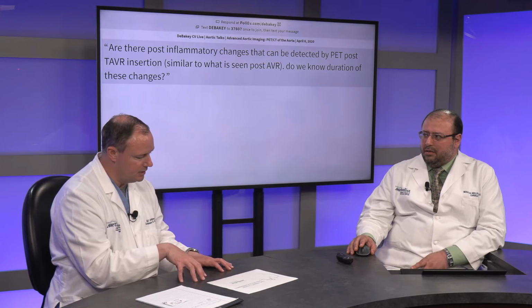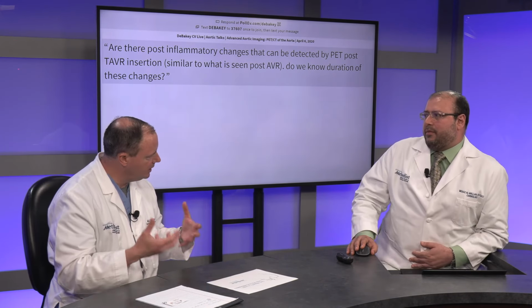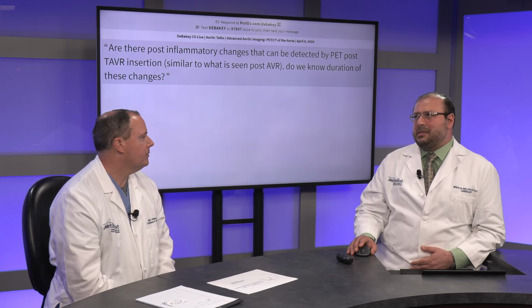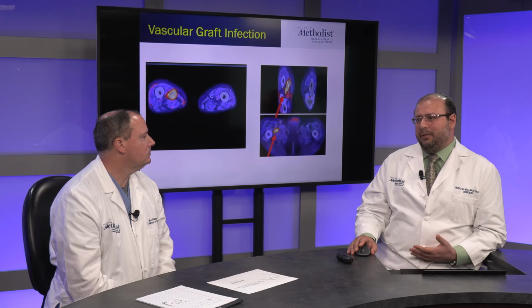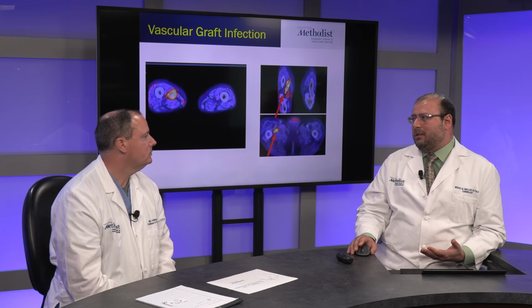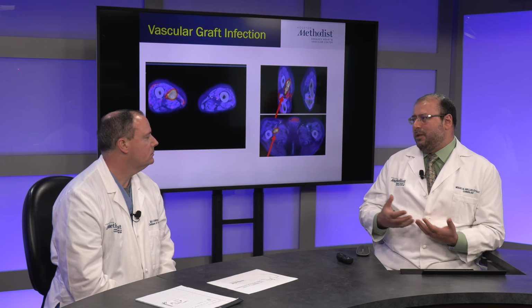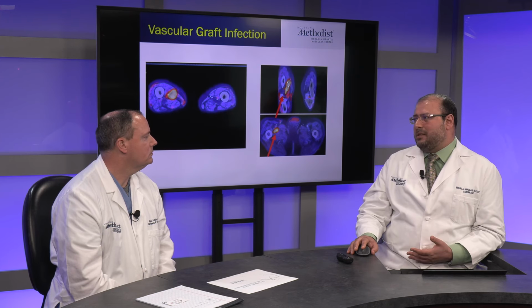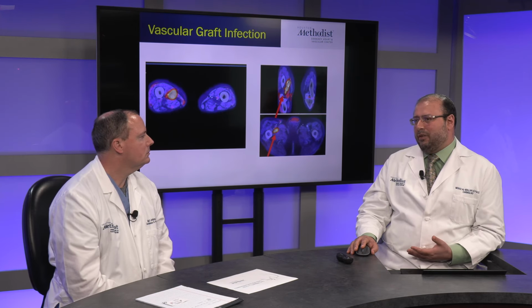You mentioned the diabetic patient that's on high dose insulin, you may not get uptake. Yeah, it depends. For stress testing, if you want physiology, PET is probably the most sensitive, and recently in a single-center study, multiple modalities were compared head to head. PET clearly came out as the most sensitive technique. So for myocardial perfusion imaging, there is no doubt that PET would be the way to go for these patients.